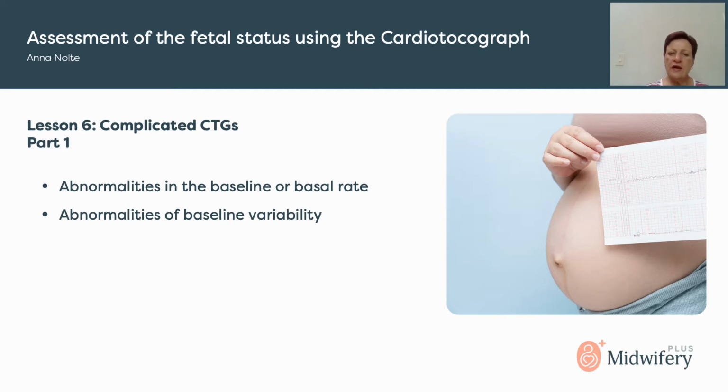In part 1 we're going to talk about the abnormalities of the baseline or the basal rate and abnormalities of the baseline variability. And in part 2 we will talk about all the abnormalities, decelerations, a little bit of accelerations, which is not an abnormality, and then we'll also talk about the contractions and the abnormalities regarding the contractions. I hope you still enjoy your course, and I hope that you still gather some new knowledge.